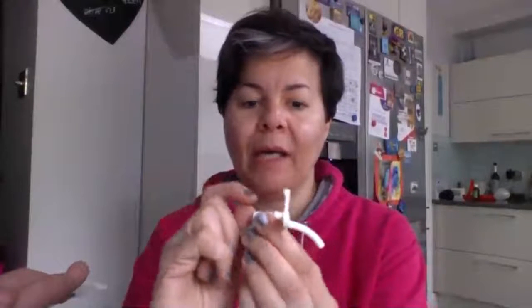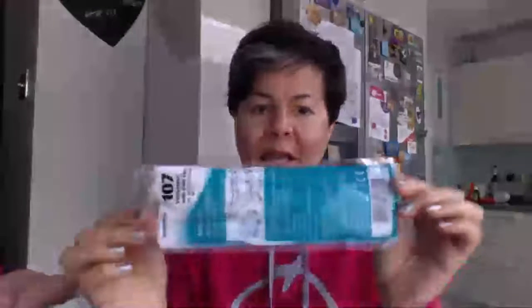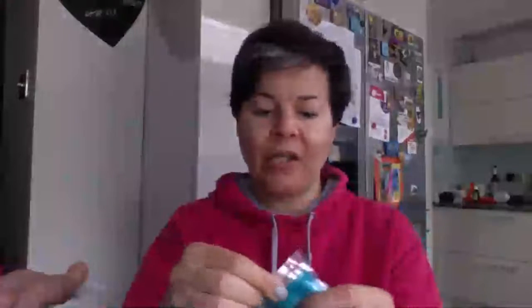Let me take this out. It's a little tube like this. And this bit here sits inside your neck. And these bits are held on by trachea tapes, which come like this. And you change them every day, or every other day in our case. Basically, they go around the back of the neck and they tie and hold the tracheostomy in place.